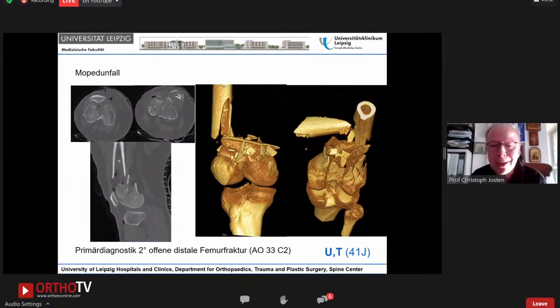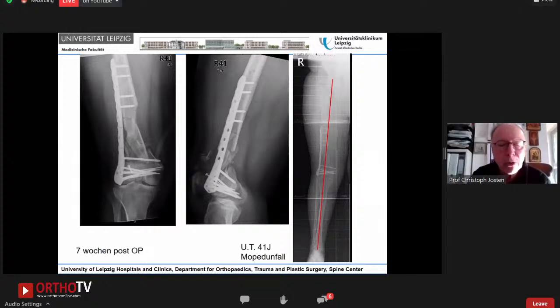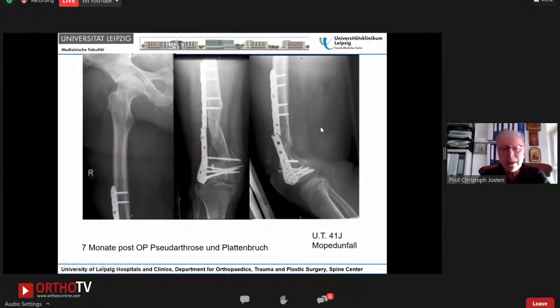You see a quite complex fracture, a C2 type fracture in a 41-year-old male. This was treated, of course, minimally invasive. And the case Christian Krettek showed you, it's difficult to get a fixation in this area. So perhaps we could have chosen a little bit longer plate, but nevertheless, it's okay. But we look, this is 7 weeks after the operation. Sorry for the German words, but perhaps you can understand it. 7 weeks later, it's a suboptimal reduction. The axis may be okay. But again, you see the breakage of the plate 7 months after the first operation. What to do?